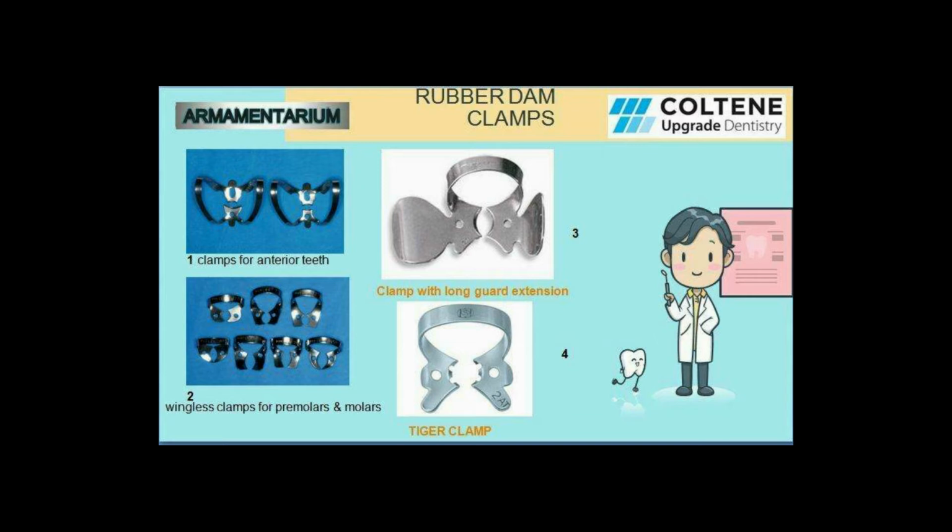On the right hand side, you're able to see a very big size clamp, which is a clamp with long guard extension. Now, this is a clamp, but it is not used with a rubber dam assembly. It has a very long guard extension, as the name itself signifies. This is used for retraction of tongue and retraction of cheek at the same time. And you can put cotton rolls for isolation also, and this clamp will be able to keep those cotton rolls there for a long time. So it is good for isolation, but it is not used with the rubber dam armamentarium.